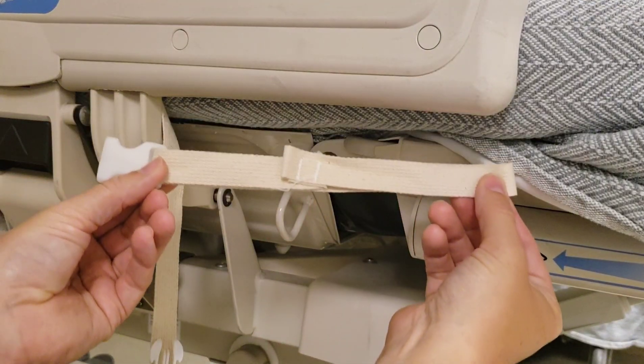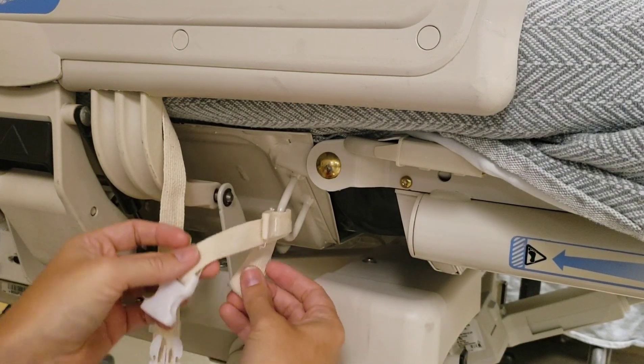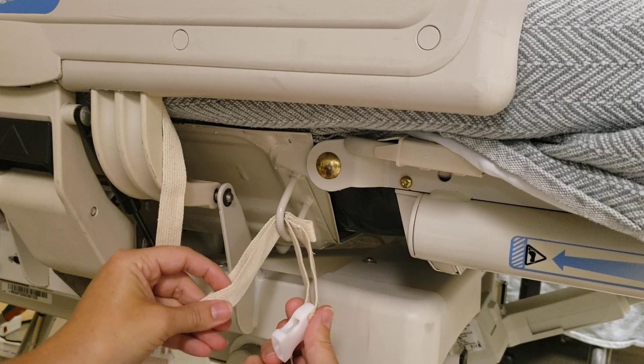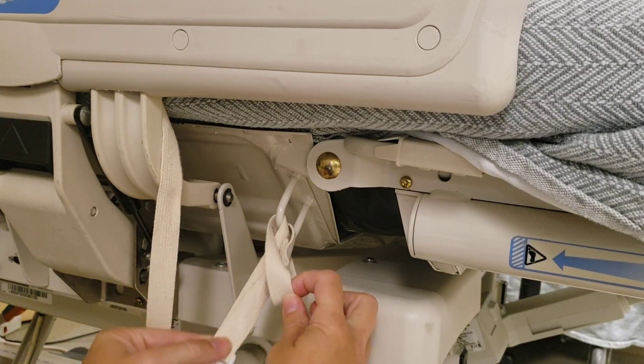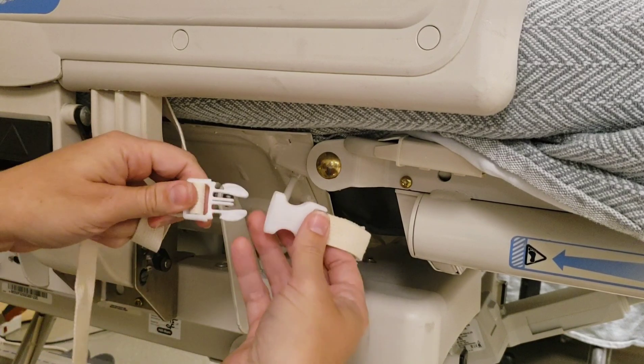To secure to the bed, always secure to the bed frame's designated hooks, never to a moving part. Use the loop provided as shown. The buckle end goes through the loop end, securing it to the bed frame. Buckle the two straps together.